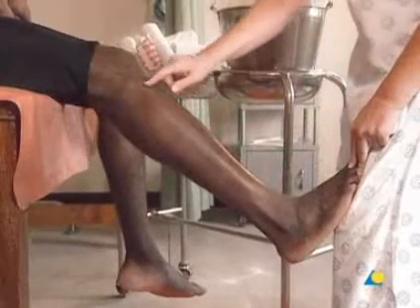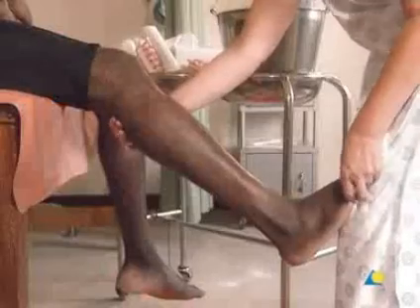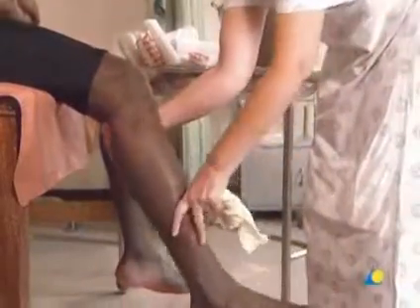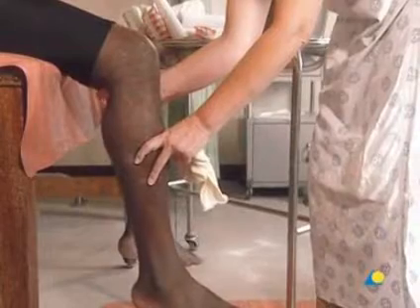The anterior proximal border of the PTB lies above the patella. The posterior landmark is two fingers below the popliteal crease, so that the patient may not bend the knee more than 90 degrees, which would cause rotation.